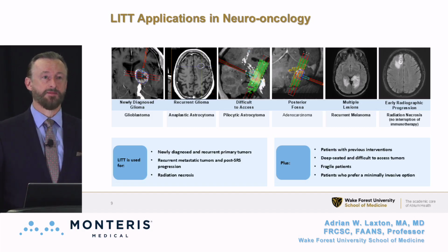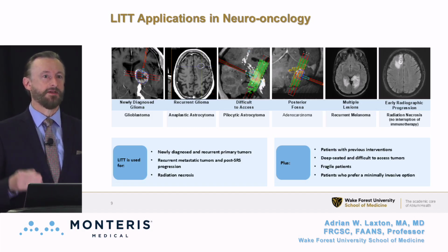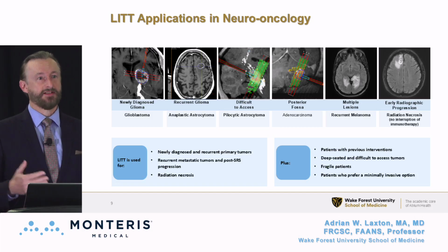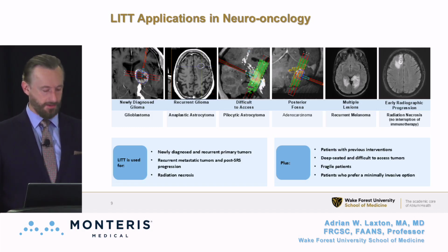This past month, I had a patient who, for a lot of logistical reasons, had a biopsy, but we couldn't immediately get her LITT. She started her concurrent Temodar and radiation, and I was able to then do a LITT procedure for her, meaning that she had 1 day where her other therapies were impacted, but otherwise no delay, no change to her adjuvant and concurrent treatment regimens. So LITT has value in all of these domains.